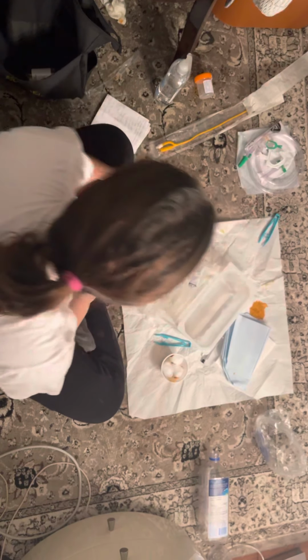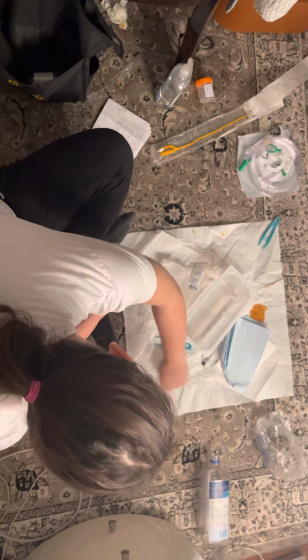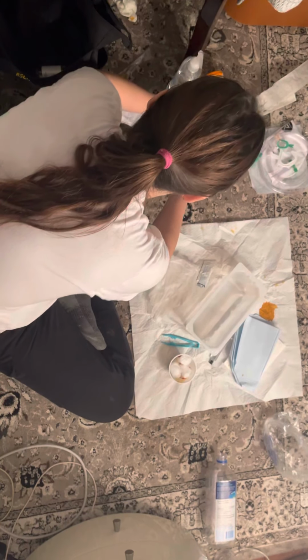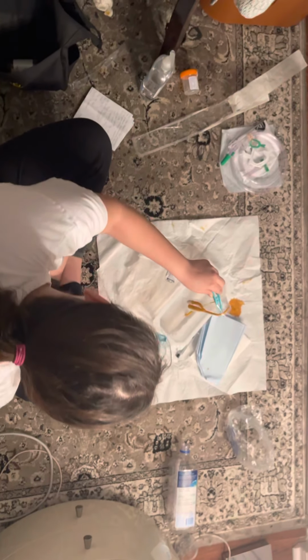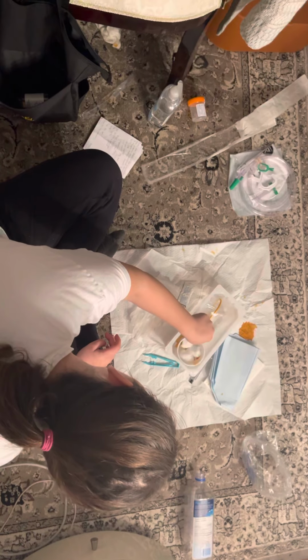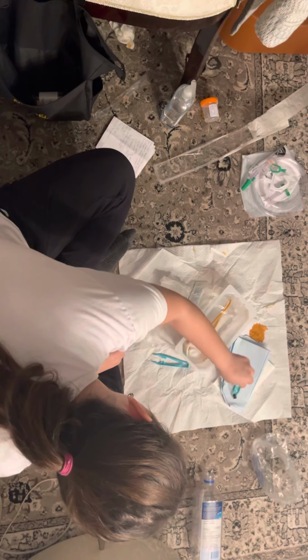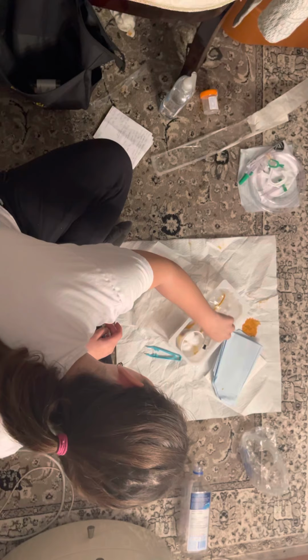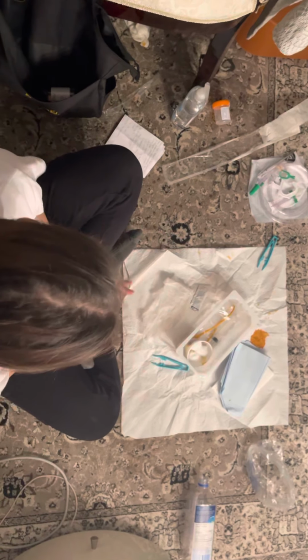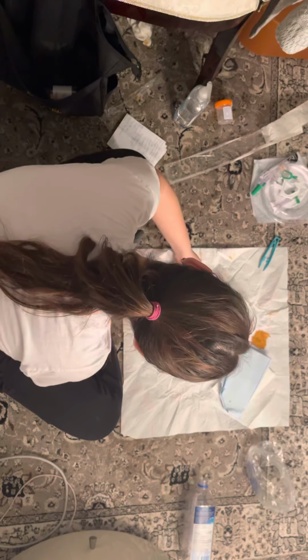So once I've done that, I'm going to begin by taking betadine and pouring it over my cotton balls. I'm also going to take my catheter and place it into the kit. I'm going to take my syringe as well, place it in here. So once I've done that, I can begin by putting on my sterile gloves.